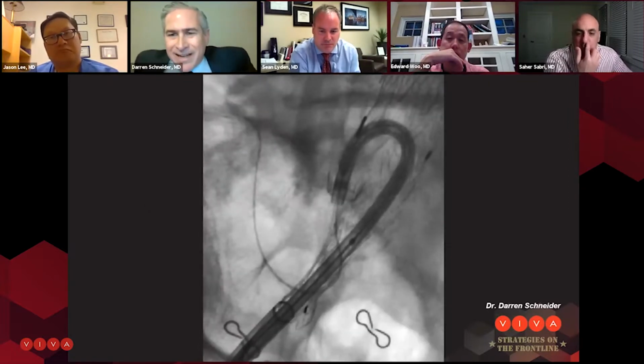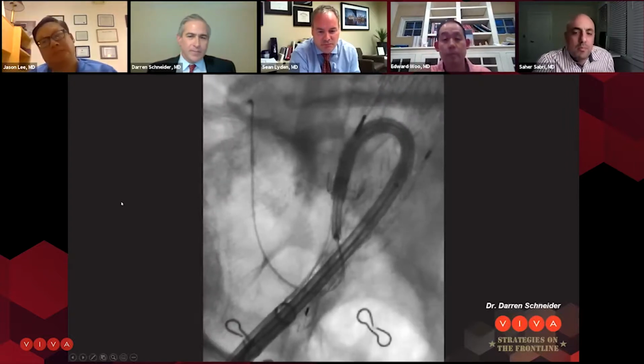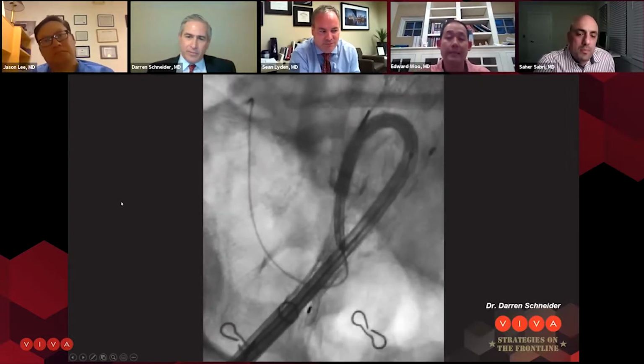What size OSCOR sheath were you using there, Darren? I believe this was an 8.5 French. And this is an 8L that we put in.